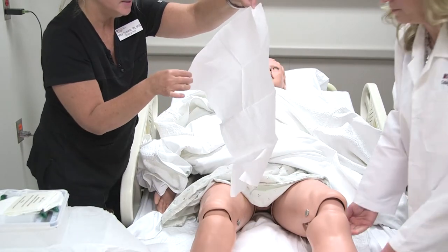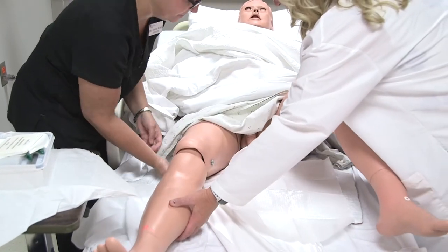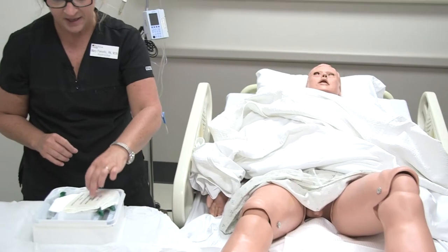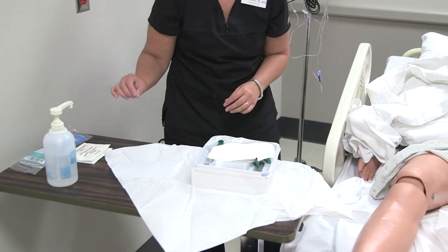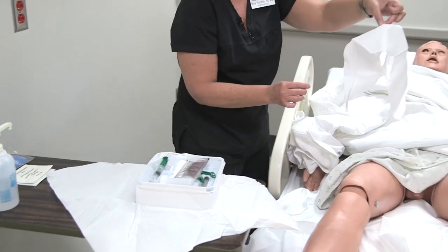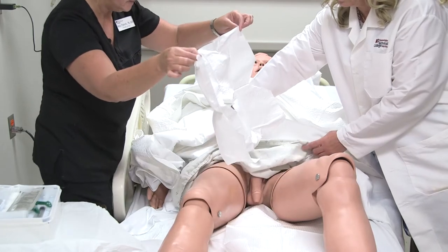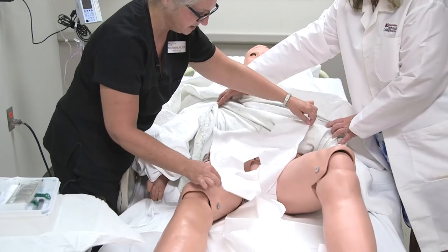All right, so my assistant's going to lift up the one leg there while I put this under. All right, very good, so we'll just let that sit there. That's considered sterile in the middle there. And then I have my sterile gloves, and I'm going to put those to the side, and I'll put those on in a little bit. And then we also have what we call a fenestrated drape, which I'm going to place, because he is a male, I'm going to use it because it helps to keep the area contained. I'm just going to lay that down here like this.